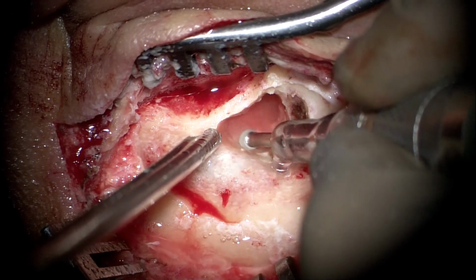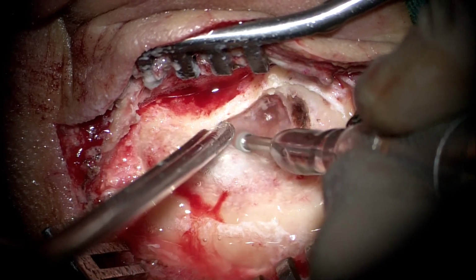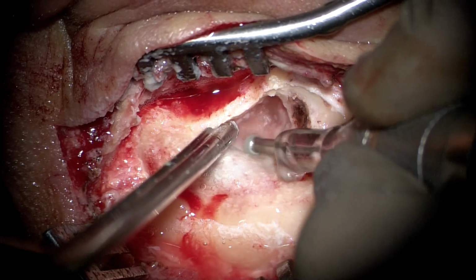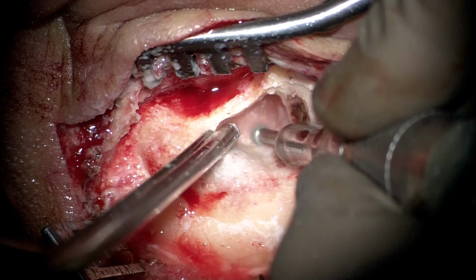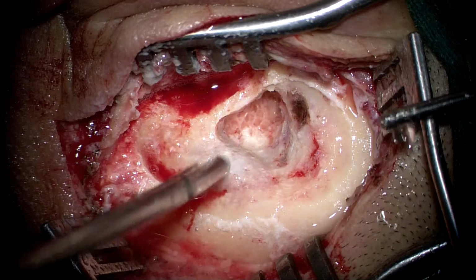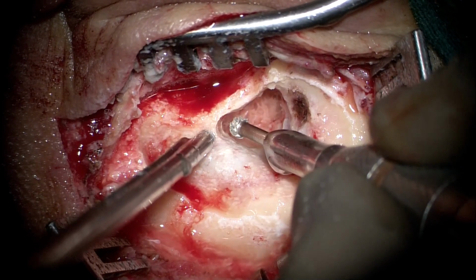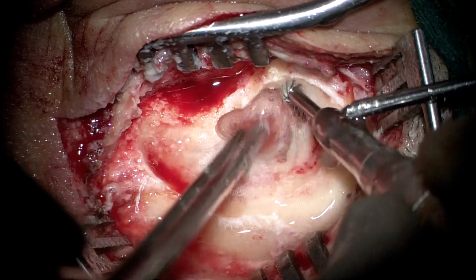surgery. You can see here that we initiate exposure of the bone in front of the sigmoid sinus as well as the sinodural angle, because this angle is very important for us to eventually achieve that posterior trajectory of vision inside the vestibule once we complete the drilling of all three semicircular canals. Leaving bone in this angle will not allow us the kind of exposure that we desire.